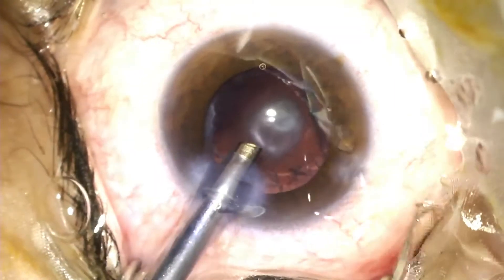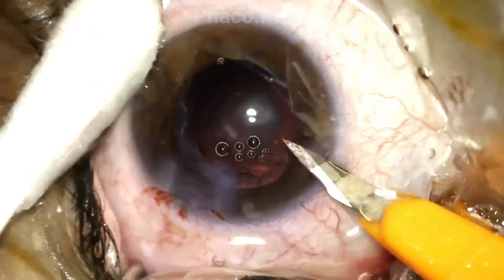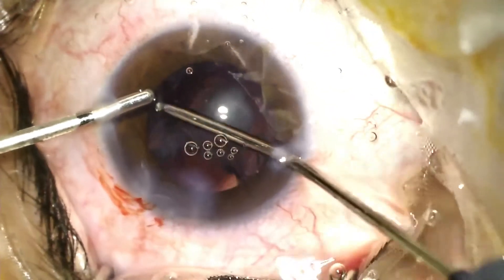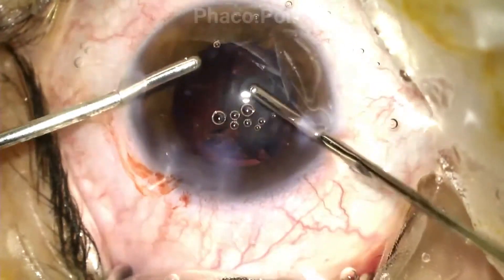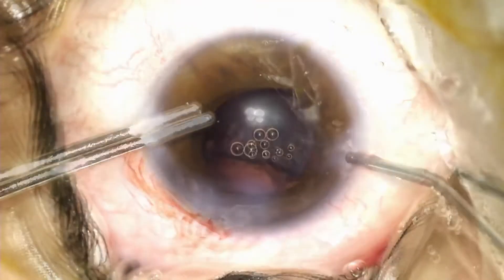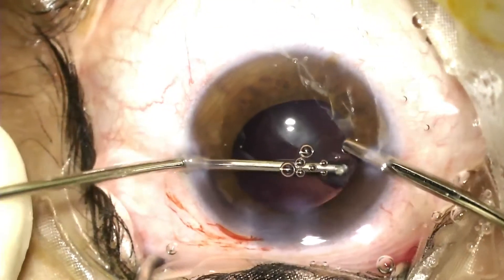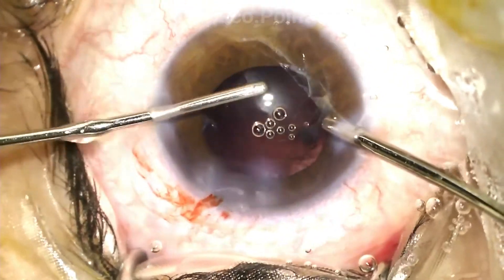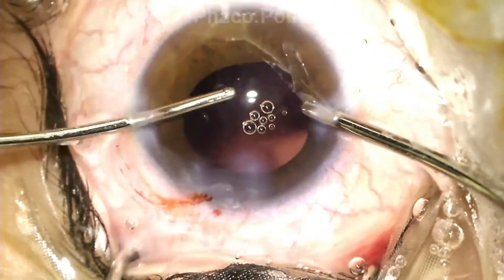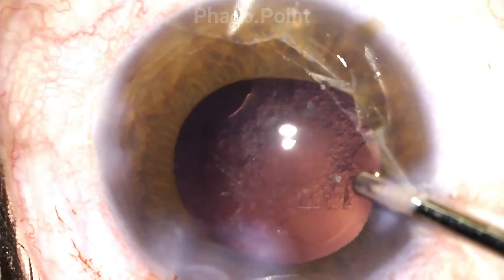Upon completion of the epinucleus removal, I once more perform a visco fluid exchange. I then proceed to performing the irrigation aspiration using the bimanual irrigation aspiration technique. The bimanual irrigation aspiration allows for significant ease of removal of the circumferential cortex from all 360 degrees. At the end of the cortical aspiration, you can actually notice there are significant cells attached to the central posterior capsule.